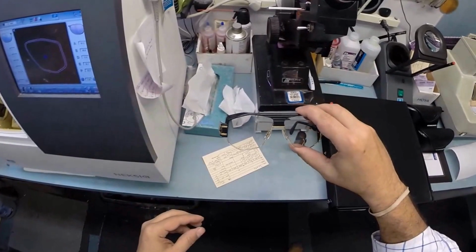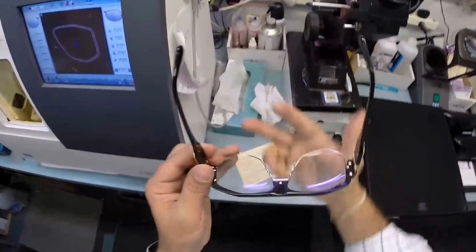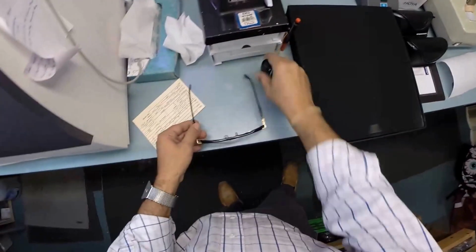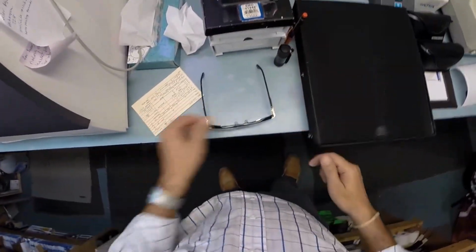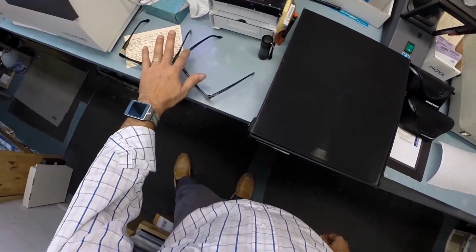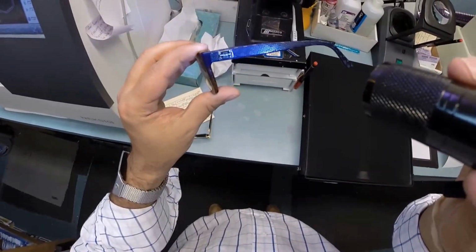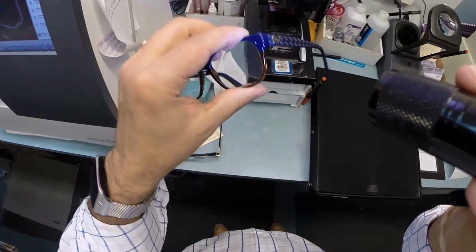But I'm going to get these in standard alignment first, also known as a 3-point stance. The 3 points are 1, 2, the bottom of the frame being 3. I set them on the counter and press down. There is no wobble. And when I say wobble, like I said, I'm part of the 80%. So when I take mine off, mine wobble on the counter, but they sit level on me. For those of you keeping score at home, I'm wearing the Versace 3199 in color blue with tortoise.